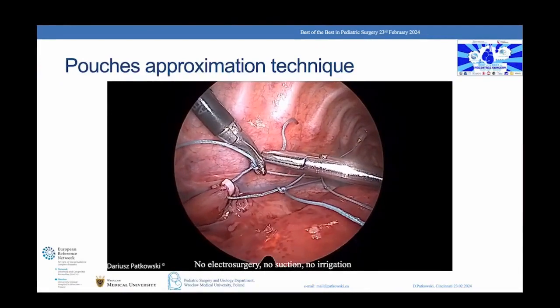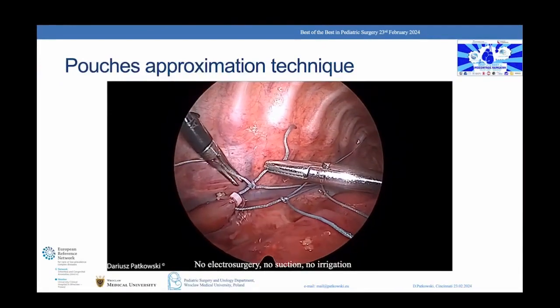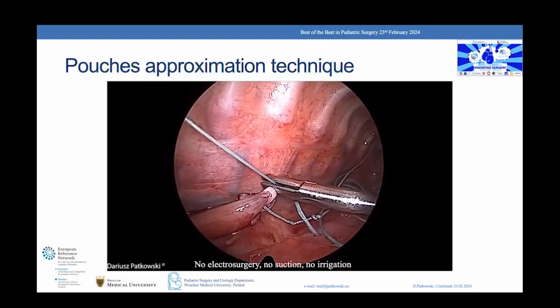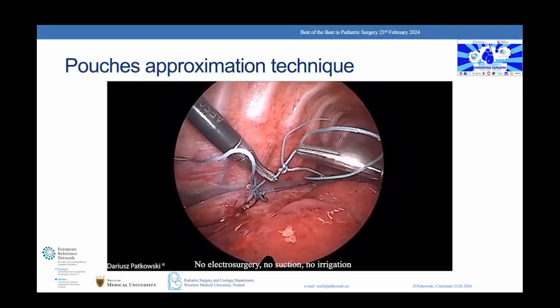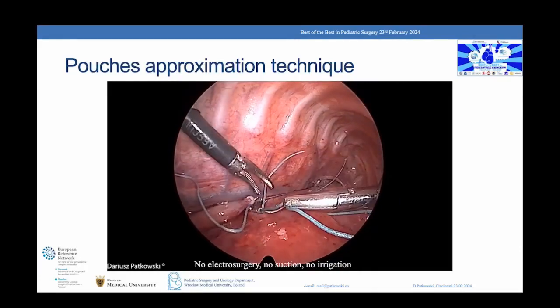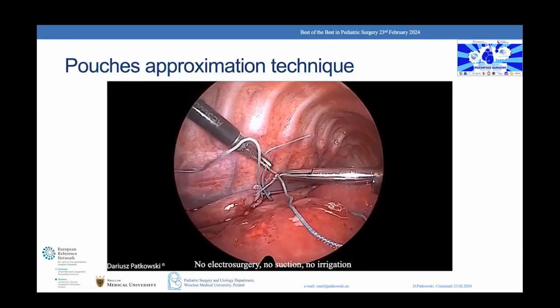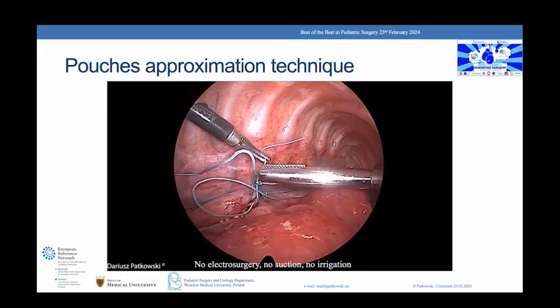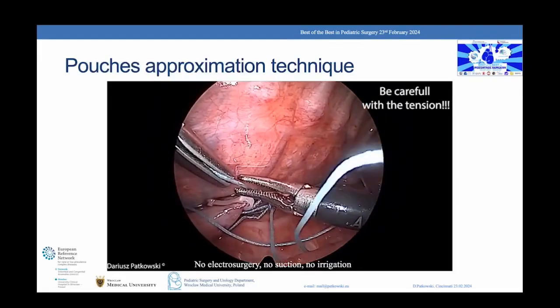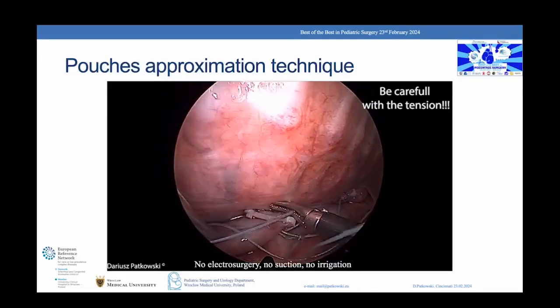If necessary, both sliding knots can be converted to move in both directions. There is no need to rush — time is needed for the tissue to stretch. Be careful when applying traction force so as not to damage the tissues. Finally, the sliding knots must be blocked.